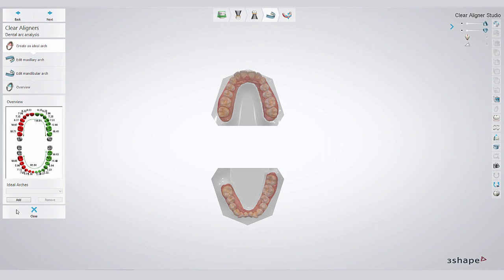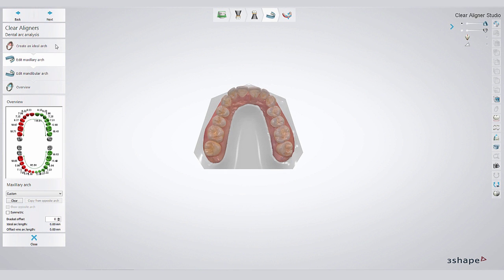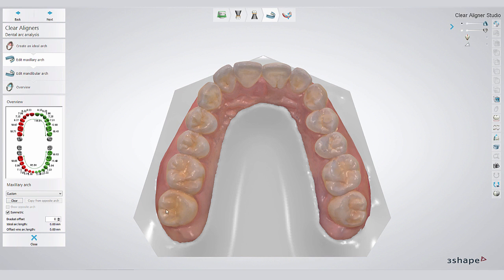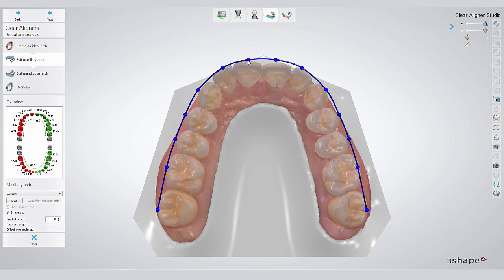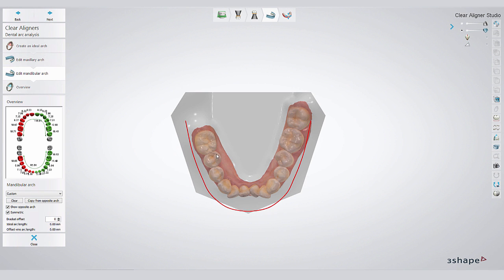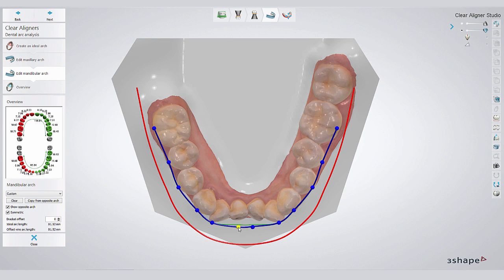The Ideal Arch feature is a very effective tool to create a reference for your virtual setup. If you activate Symmetric, it becomes a very efficient and fast workflow where you achieve a symmetrical arch form for your maxillary and mandibular arch. You can even mirror the opposing arch, and then shape and form your reference accordingly.